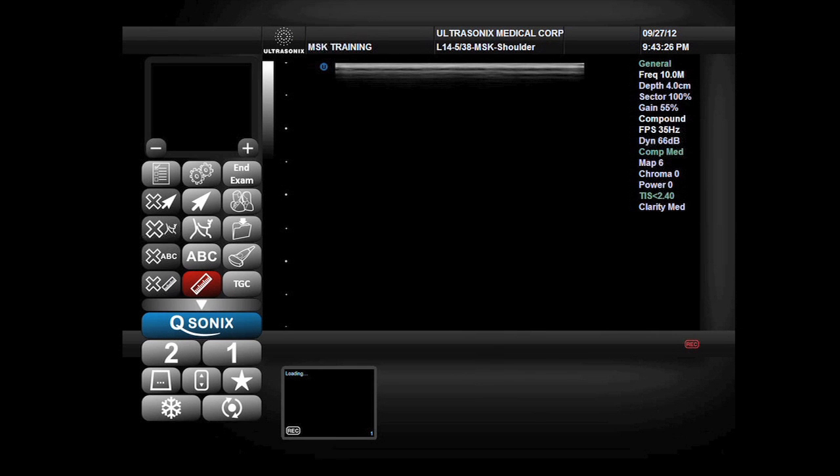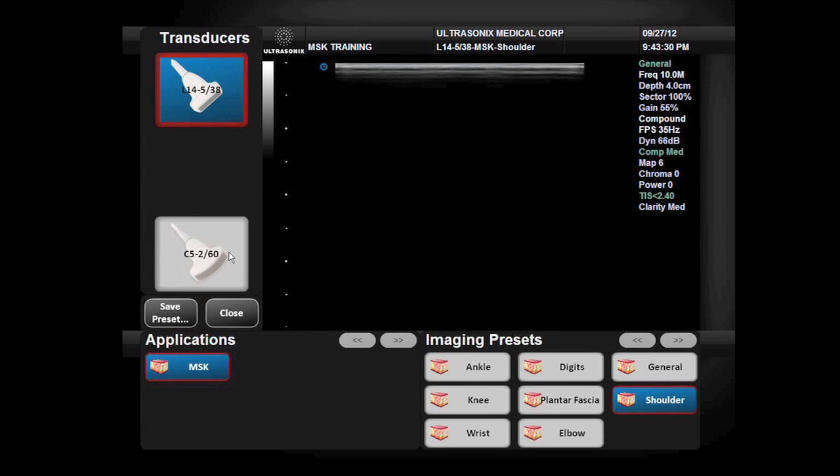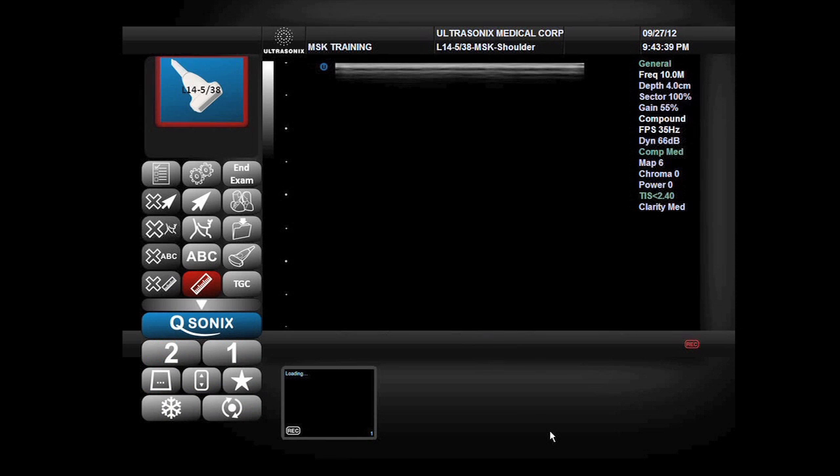To establish the correct parameters for the elbow examination, I also need to select the appropriate probe. I will select the L14-5 linear array probe, the MSK application, and the elbow preset.